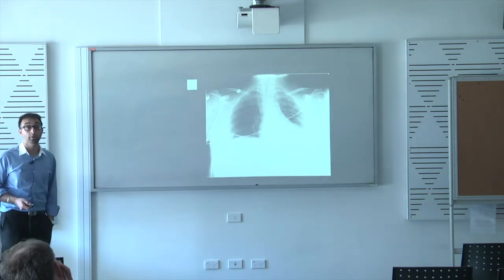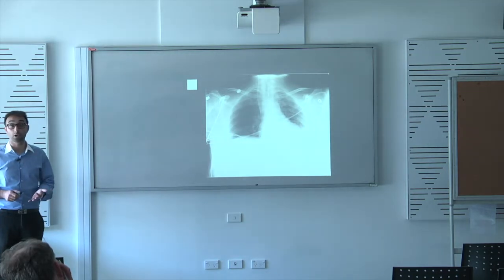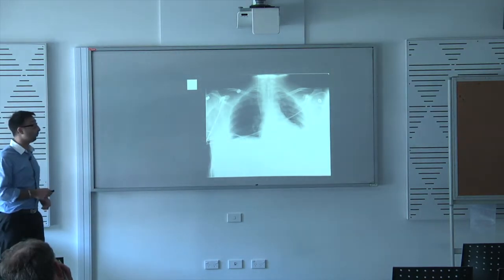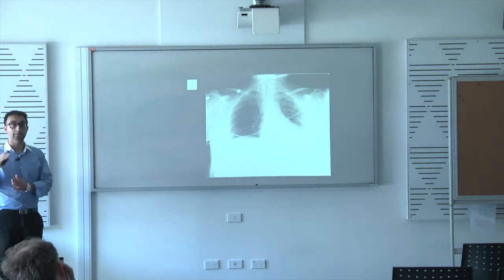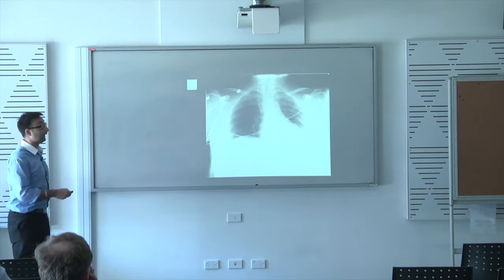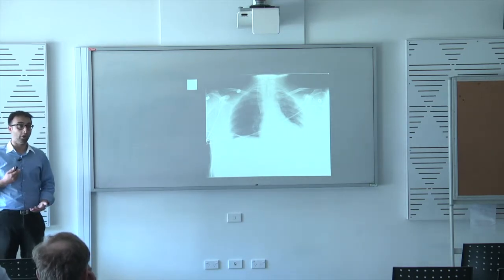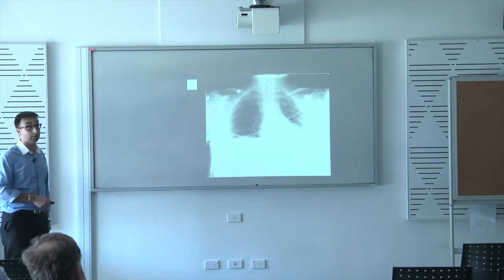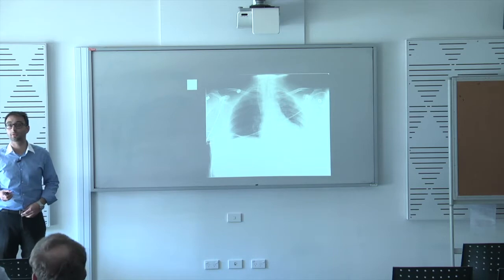A good rule of thumb is if there's an ET tube in and the patient is supine, on a mobile film, you ideally want the ET tube around the heads of the clavicles, because once you take movement at the head, particularly when they're supine, the tube can drop down a lot further. So if it's about the level of the clavicular heads here, then you can say it's pretty safe. If they're in a standing radiograph, then you probably want it a bit lower. It's kind of what we use as a guideline. I'm sure other people have different thoughts on that.